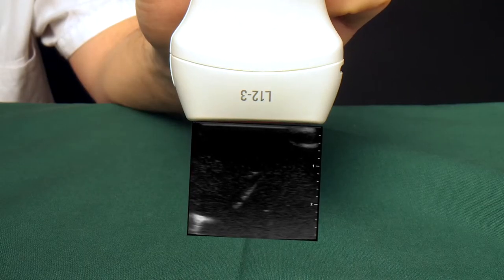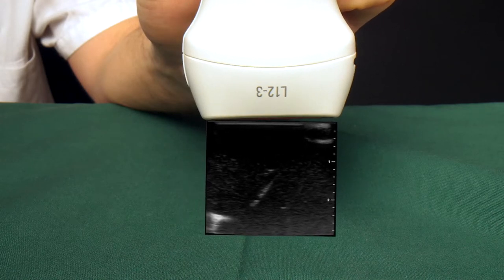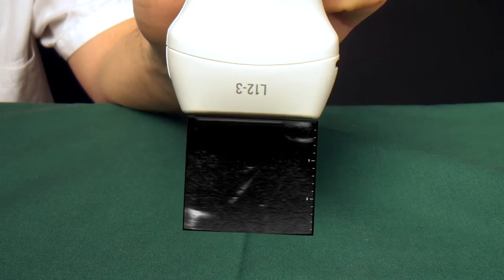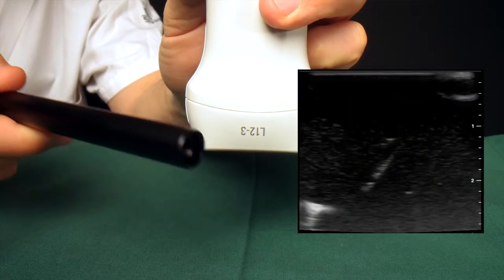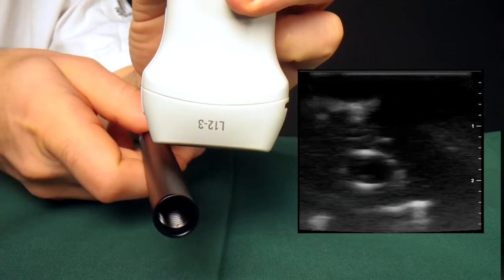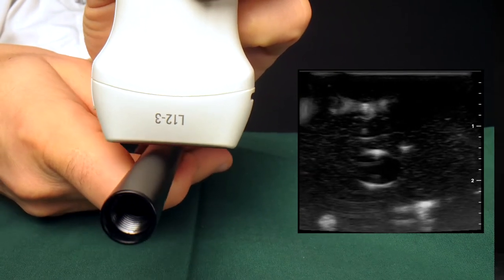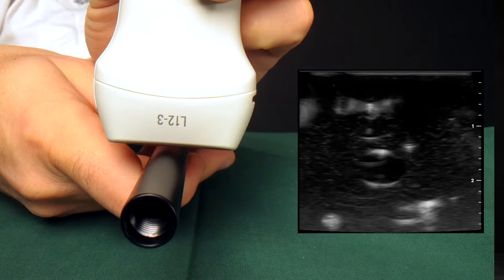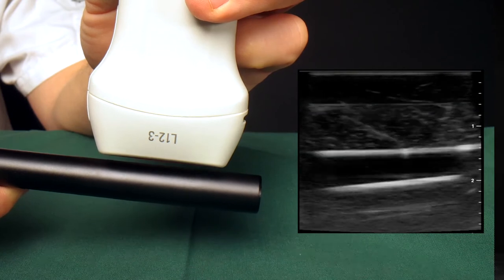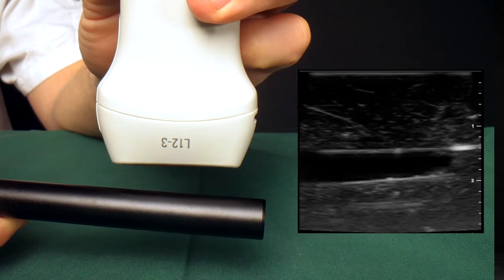The ultrasound fan originating from the probe creates a 2D picture on the screen. How we rotate the probe determines how we visualize the vessel in this 2D picture. The vessel is essentially a long tube. If we place the plane across the vessel, we get the short axis view, and the tube appears as a circle. If we place the plane along the vessel, it's called the long axis view, and you see the length of the tube.